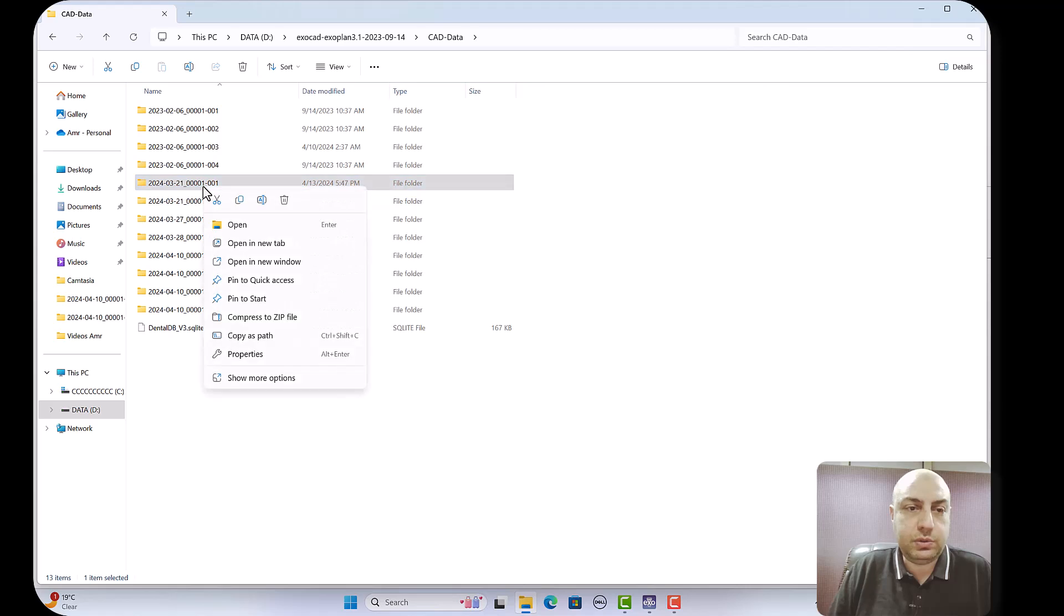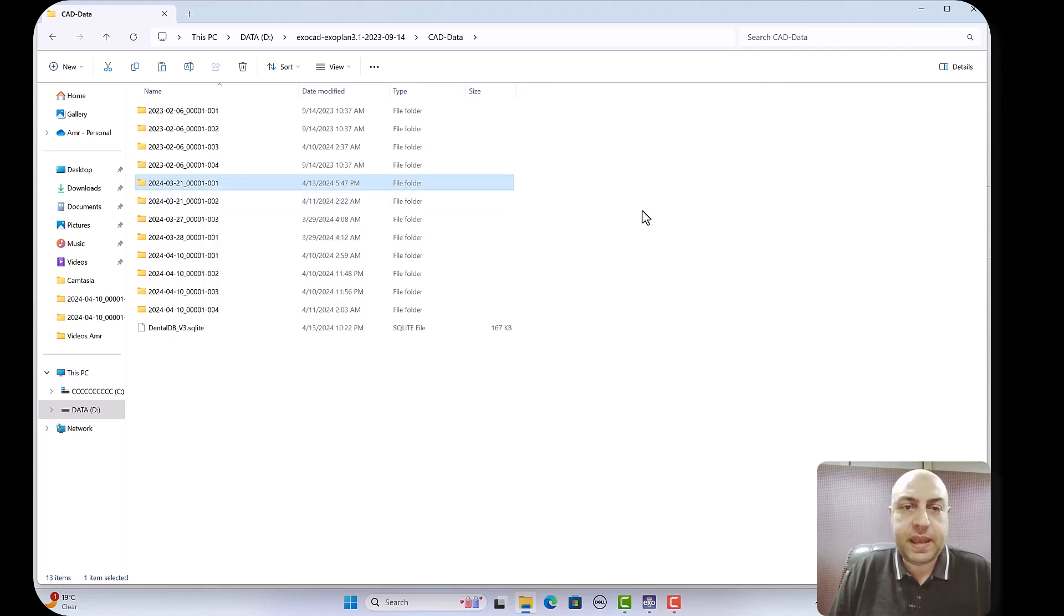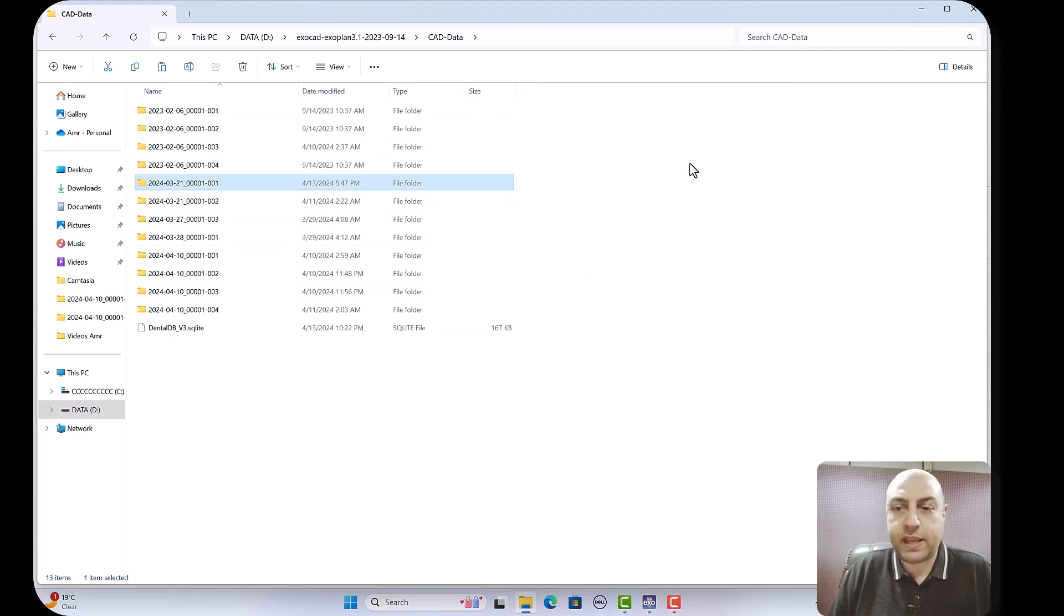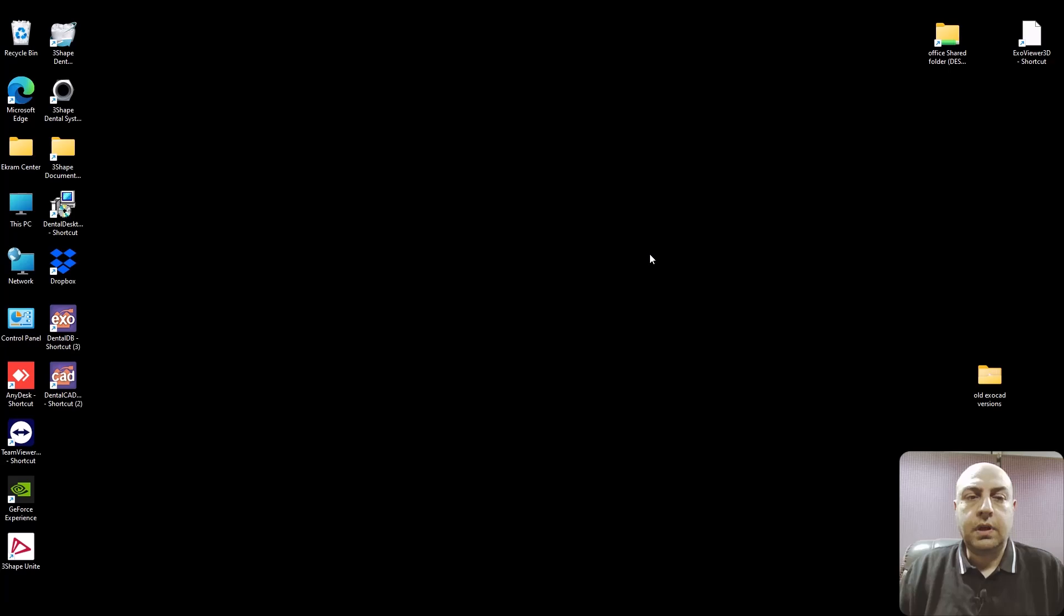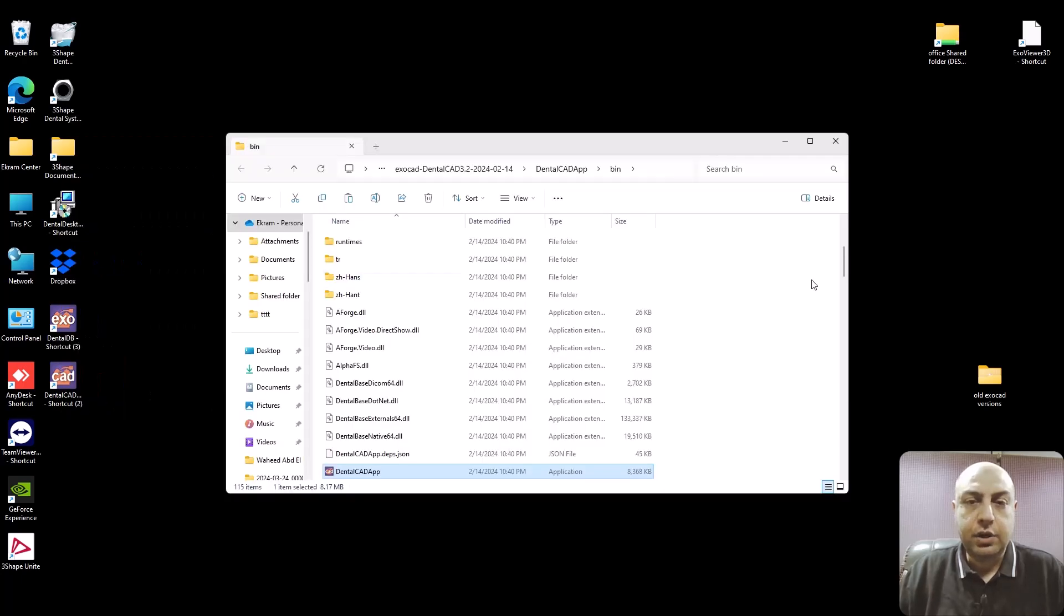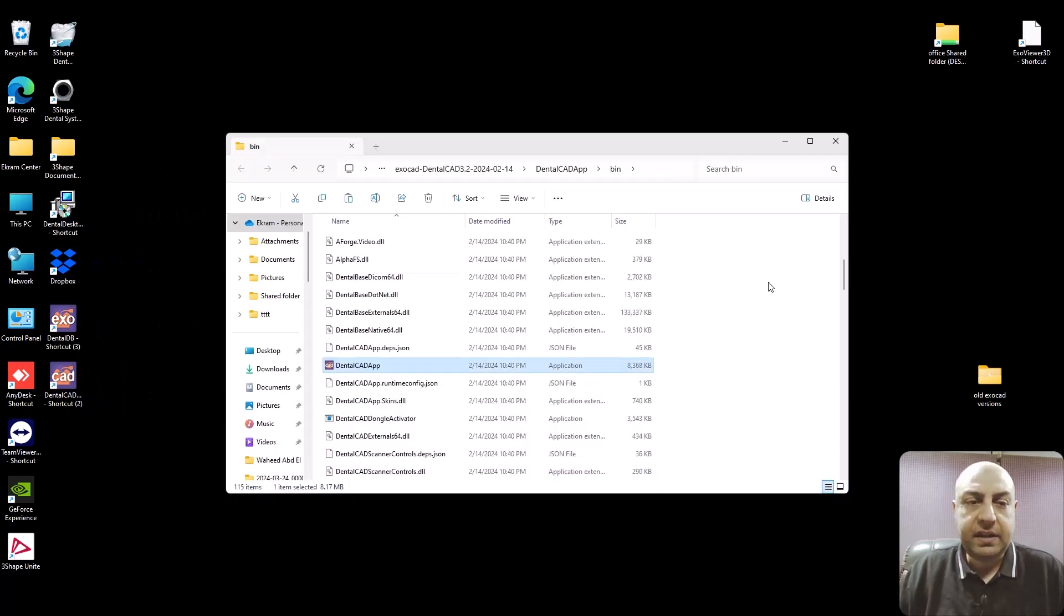So now you need to have a copy and we'll paste it in the Exocad database, the one like this one but for Exocad. Now go to your desktop and you have the Exocad and the cad icons. Go to the cad icon.